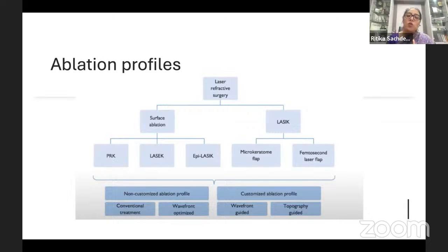And we were able to also use some aberrations like the spherical aberration for an advantage like depth of focus. And whenever you correct more, you use more tissue, right? You add the complexity of using more tissue. So a realization came: do we need to correct the baseline aberrations of the eye, or should we just refine the refractive procedure such that we remove the glass power without inducing the aberrations that we are inducing?